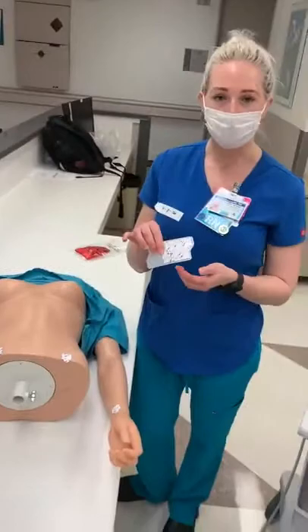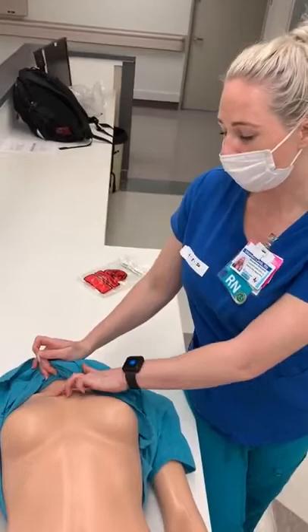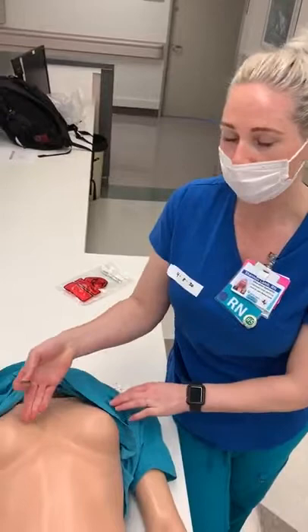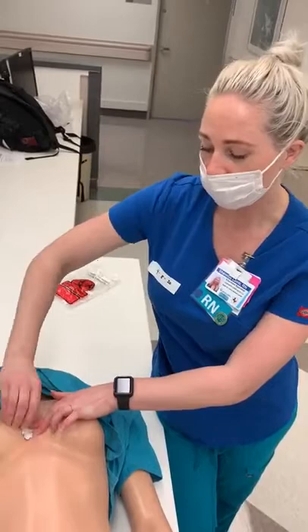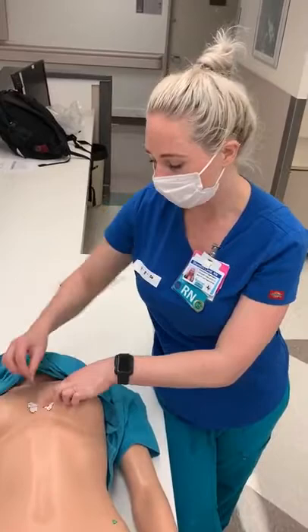Next I move to my precordial leads — I have six remaining. The first lead you're going to put on if you're doing a left-sided chest EKG is lead V1. You're going to find the patient's sternum, come down, and palpate for the spaces between the ribs. We want to find the fourth intercostal space, which is usually about in line with the nipples, and put that sticker just on the inside of the sternum — avoiding any bony prominences, dressings, or anything like that. Lead V2 goes just on the other side of the sternum, on the left side of the chest, fourth intercostal space.